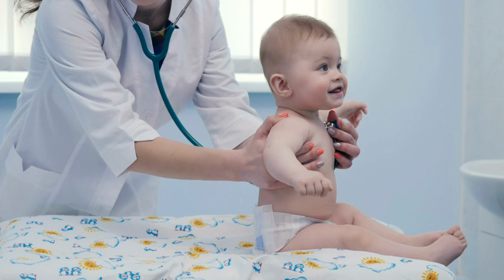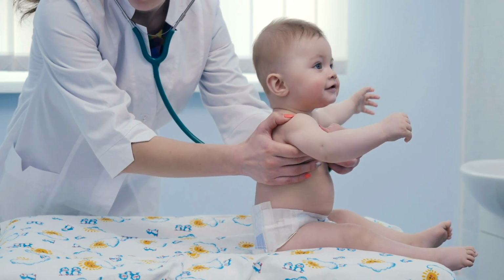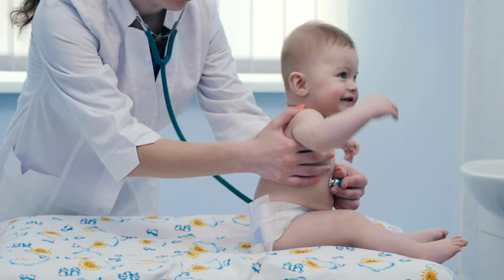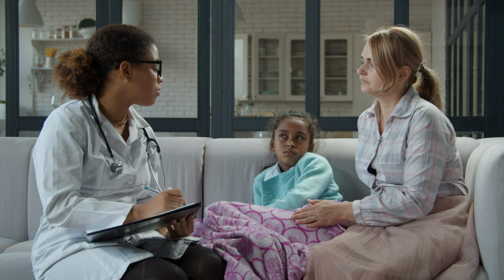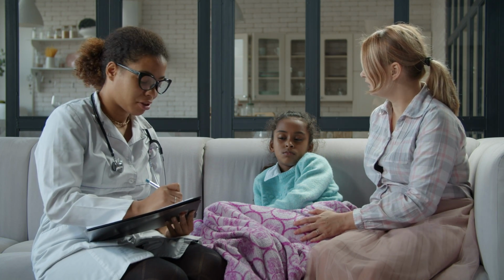The stethoscope is simple in design and is pretty easy to use, but it does have some significant drawbacks. For our project, our goal was to make an electronic alternative to the stethoscope, specifically addressing three of those drawbacks: inaccurate sound perception, uncontrollable sound amplification, and the lack of acoustic data collection. We chose those three because they play a pretty big role to hinder doctors' efforts to treat patients.